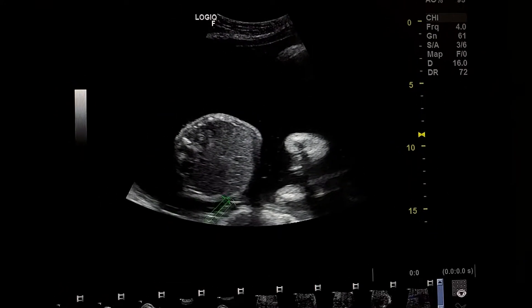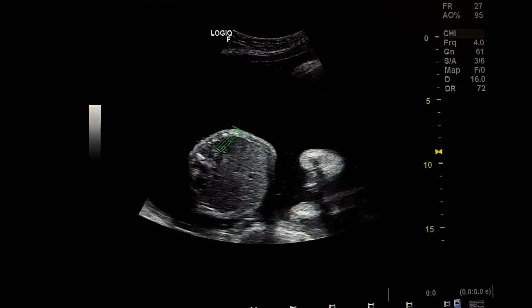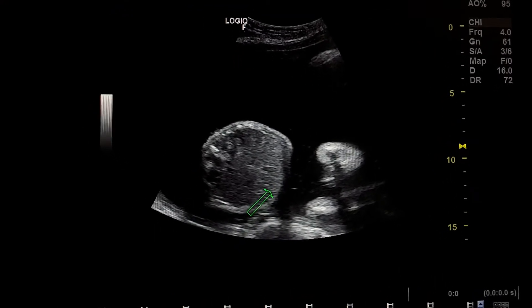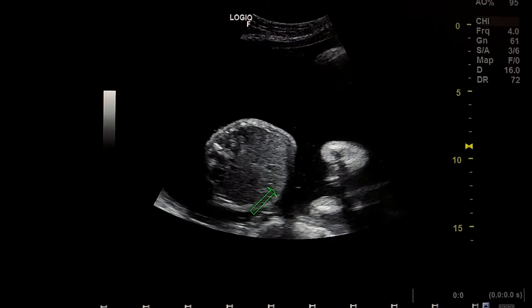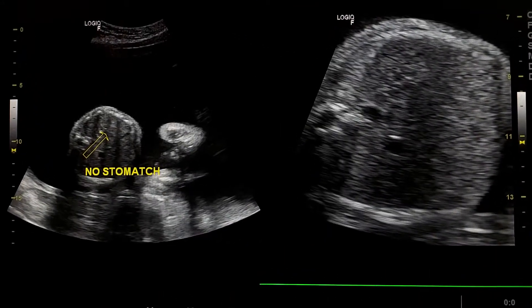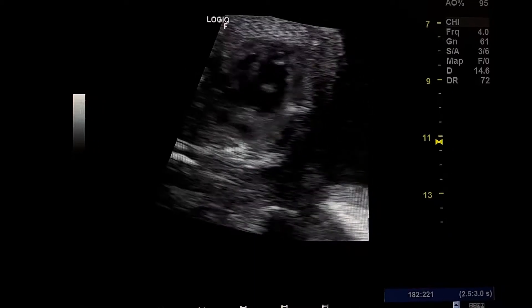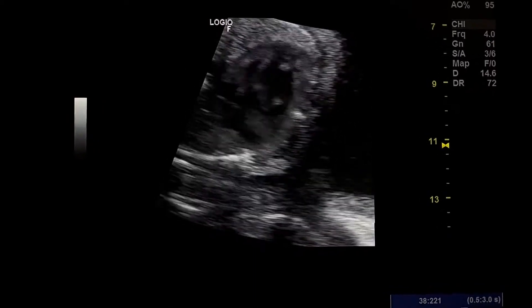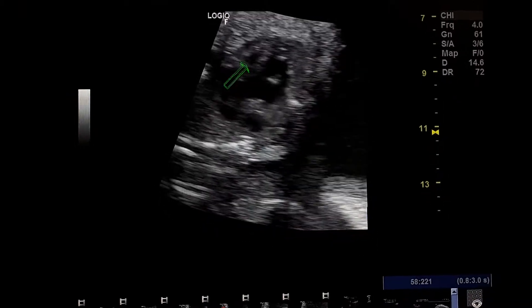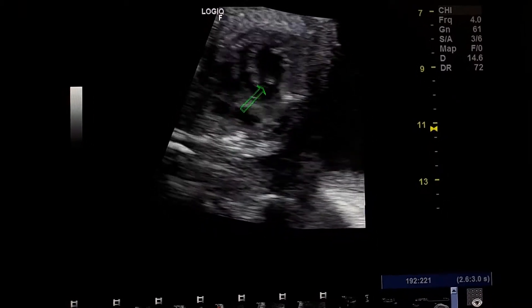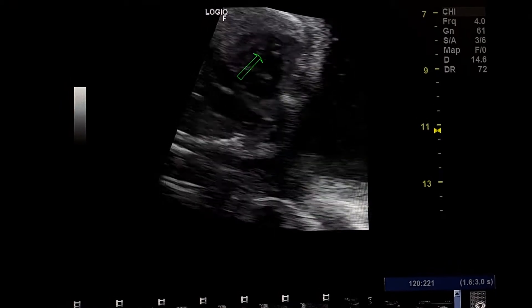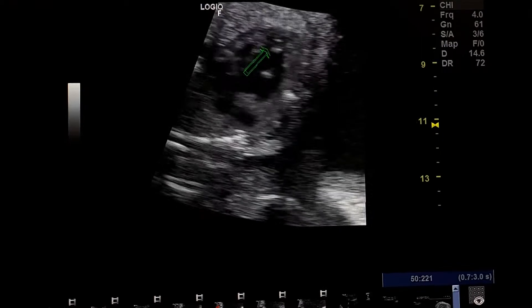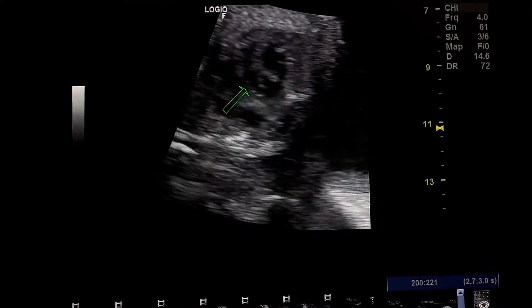Here we see the polyhydramnios around the fetus. This is the four-chamber view of the heart again: small left ventricle, incomplete interventricular septum, and the axis of the heart is increased.